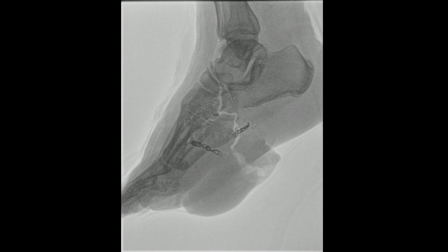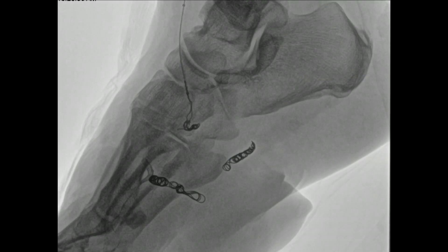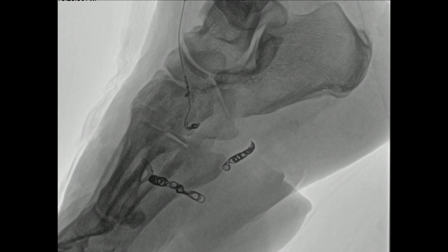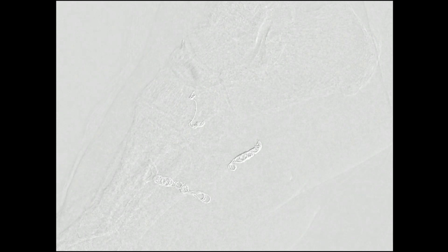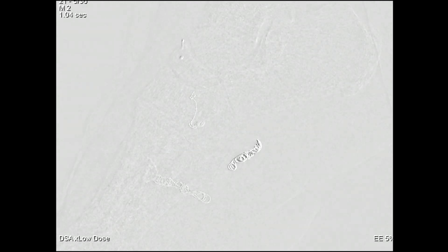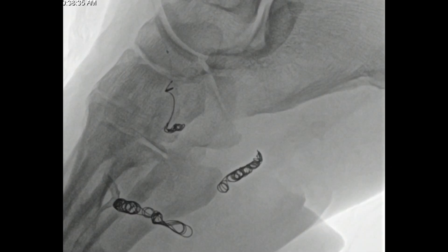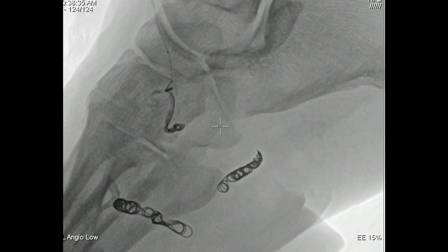We went into that branch and deployed some coils, and also put some onyx in there. The onyx was deployed through the directional microcatheter. One challenge was with the coil — we almost lost it back up into the feeding vessel and had trouble disconnecting it, but eventually it disconnected. You can see that branch which was filling the aneurysm is now occluded.